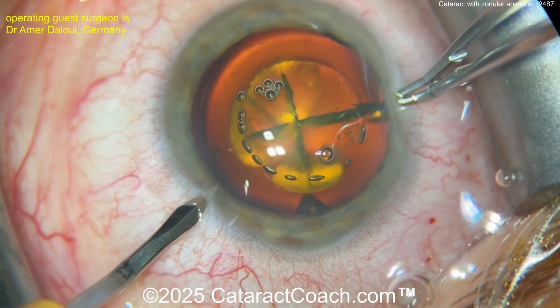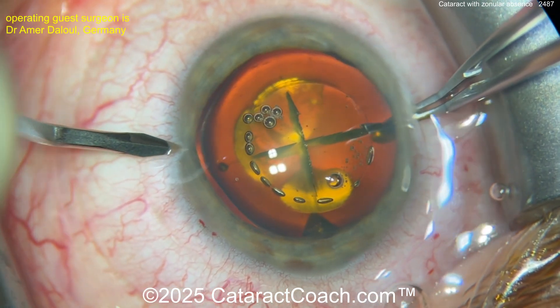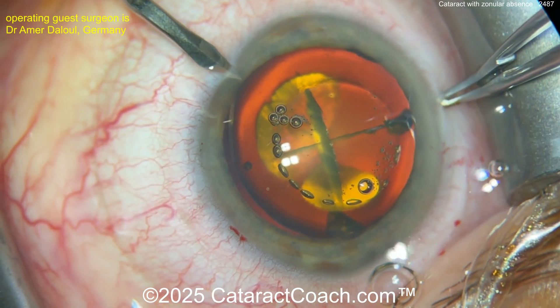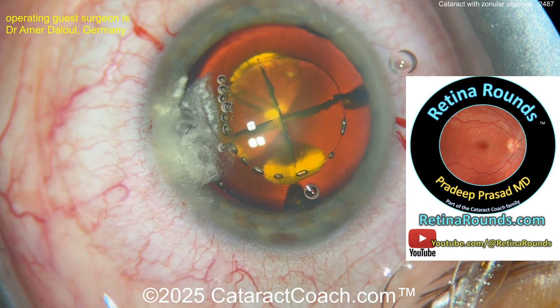Remember, the laser can create the capsulotomy using laser energy — you don't have to have that tearing action which requires some counter-traction. The surgeon is making a couple of paracenteses here, probably to put in some capsule retraction hooks or capsule stabilizers.